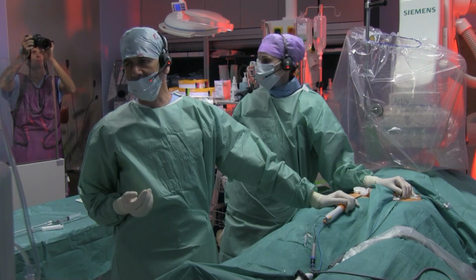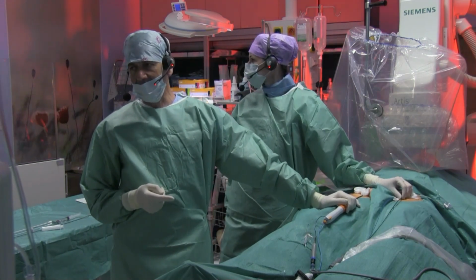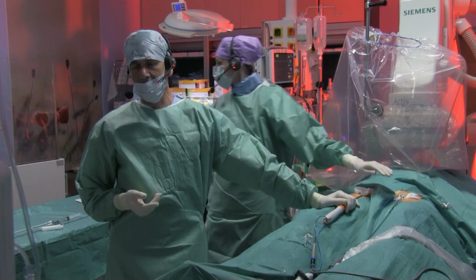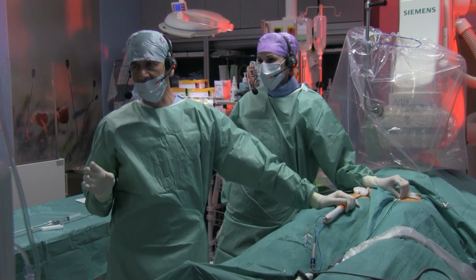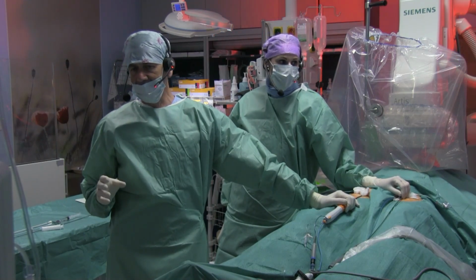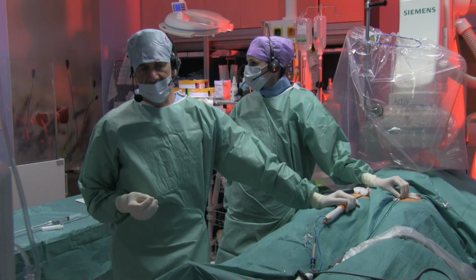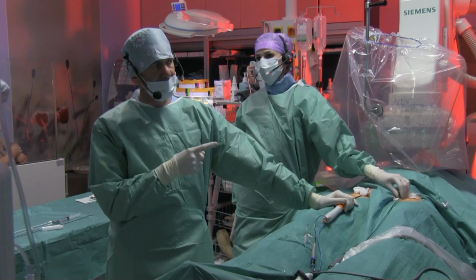Because in my lab, I don't use other catheters. I just use this one, and I don't have a backup catheter. So when it's a bradycardic patient, I prefer. But honestly, when I have this kind of patients, I prefer the Q dot. Because when a patient is bradycardic, I also usually do neuromodulation because this increases the success rate. In this case, the bradycardia was related.